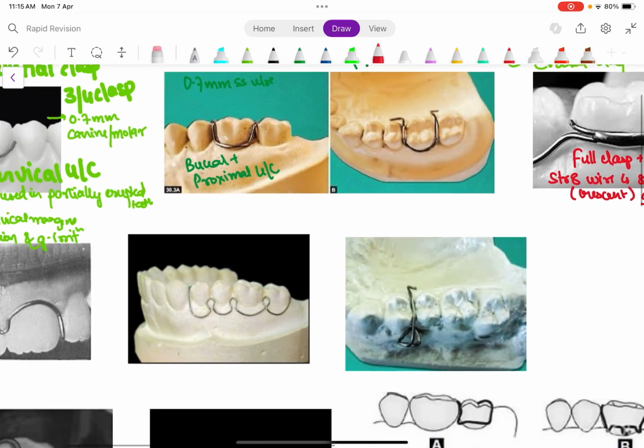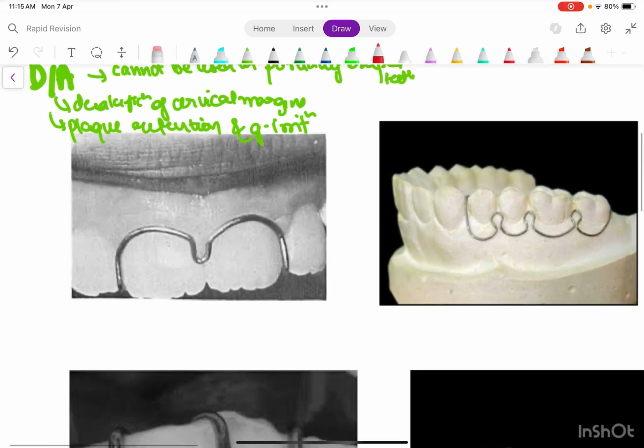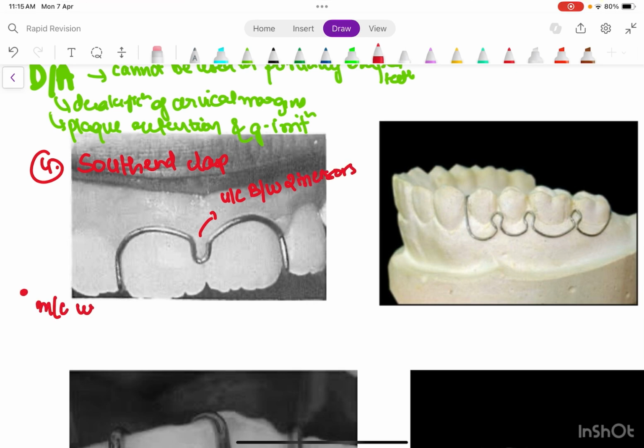All right, now let's talk about this one, fourth. So this is a south end clasp. Now this involves the undercut between two incisors. It is most commonly used for additional retention, and it is contraindicated in proclined anteriors.